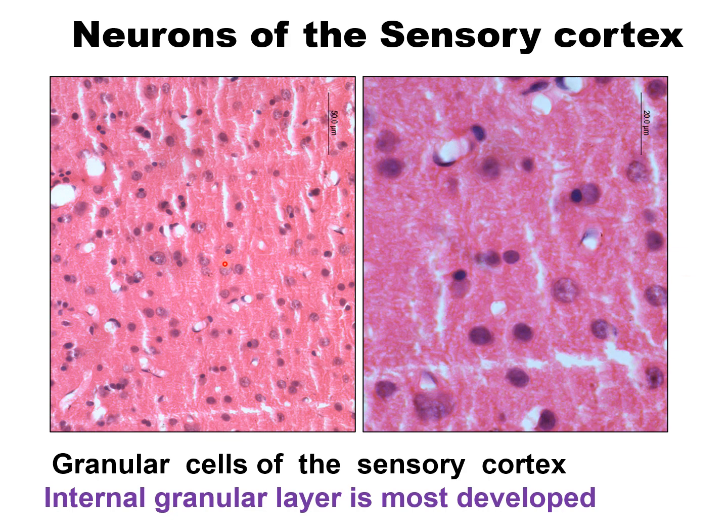This is in higher magnification of the sensory cortex. In low power, one can identify small granular cells. There are some large granular cells. In higher magnification, you can identify these large granular cells and small granular cells. In the large granular cells, you can identify the nucleus and some amount of cytoplasm with Nissl granules. But in the small cells, cytoplasm cannot be identified.